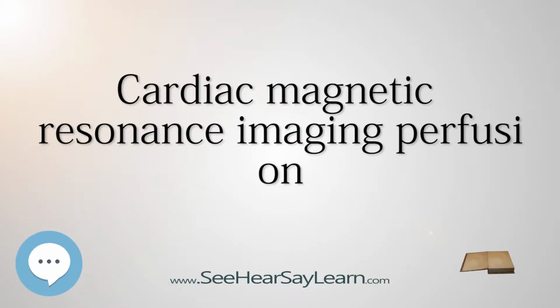Cardiac magnetic resonance imaging perfusion, cardiac MRI perfusion, CMRI perfusion, also known as stress CMR perfusion, is a clinical magnetic resonance imaging test performed on patients with known or suspected coronary artery disease to determine if there are perfusion defects in the myocardium of the left ventricle that are caused by narrowing of one or more of the coronary arteries.